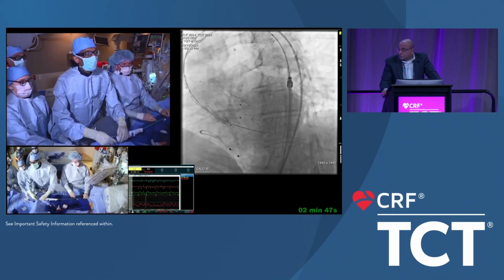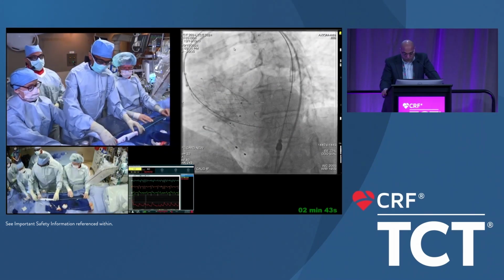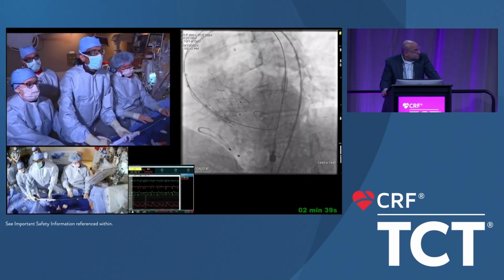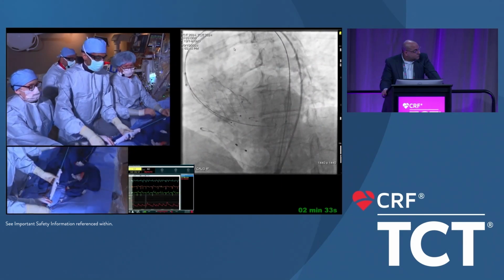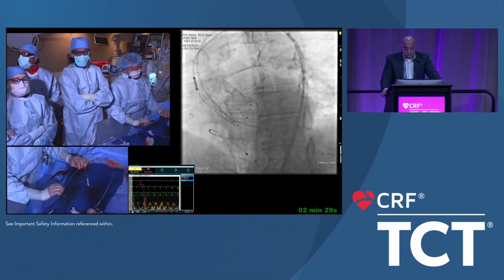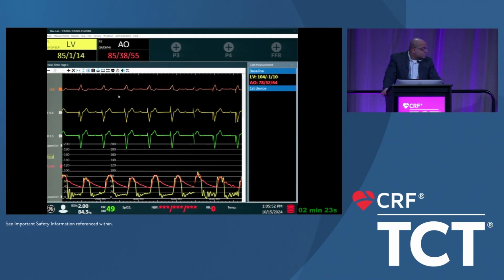I agree with you, Vinod. I also think that bar is variable. So, looking at PVL on a surgical valve is very different than looking at PVL after a transcatheter valve. The direct jet you get from a suture that's not there is very different than the waterfall jet that's sometimes hard to see or you can't see at all, even on TEE. Great gradient.